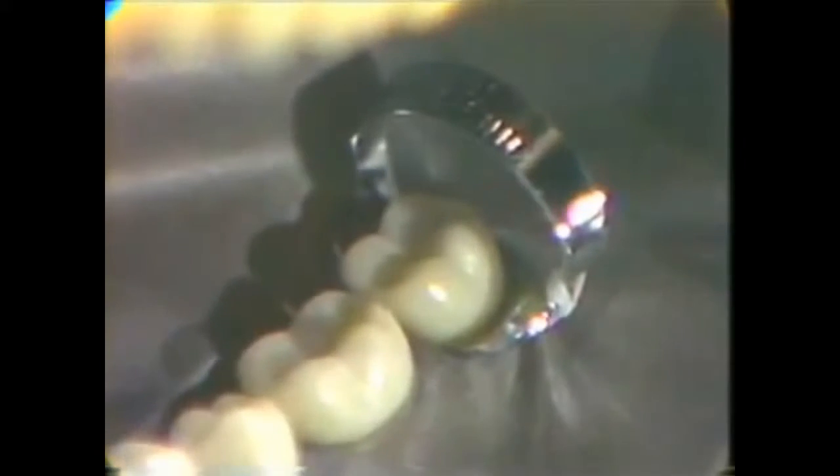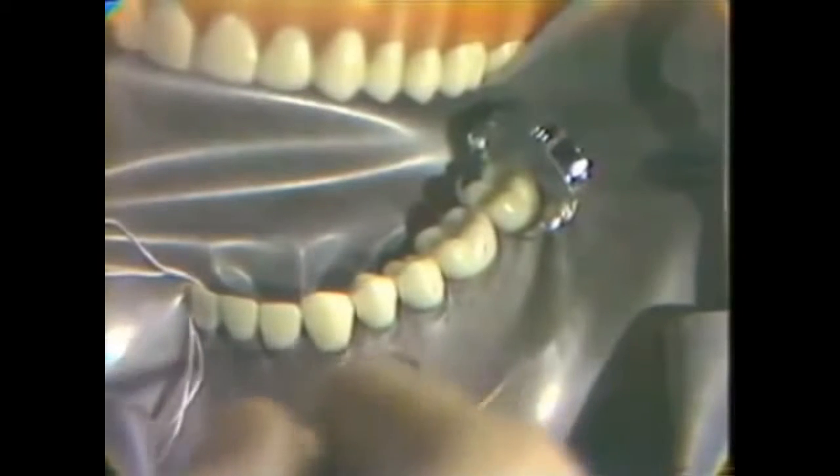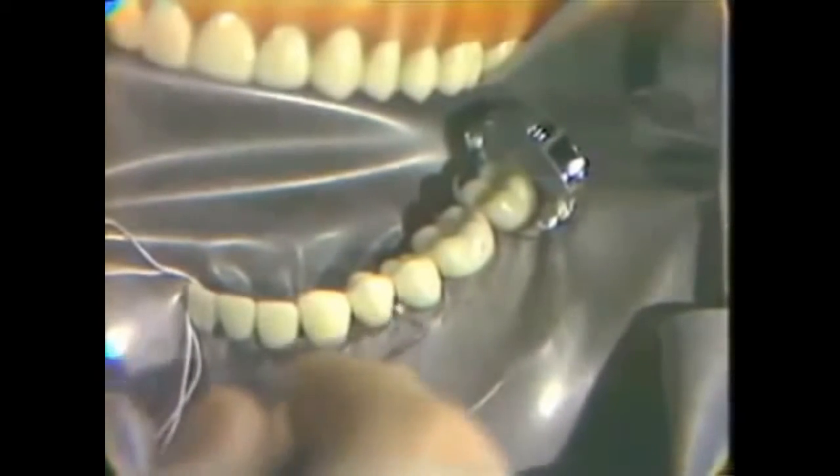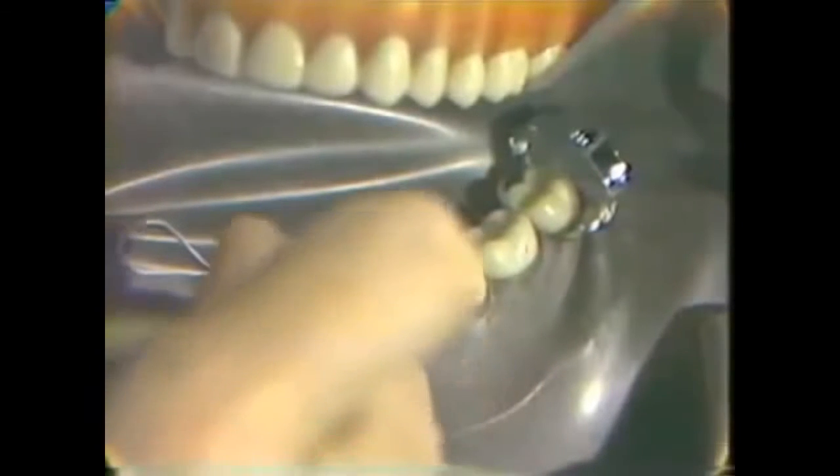Now it's possible to go back to the placement of the rubber dam and carry through these other contact areas. And finally, it's necessary then to do the eversion of the rubber dam. After the rubber dam has merely been placed, as is shown here, the rubber dam material is coming upwards on the surface of the tooth. It's now necessary, in order to produce a moisture seal, to use the spoon excavator and going carefully around the tooth to evert the rubber dam so that it is turned downward into the gingival sulcus.